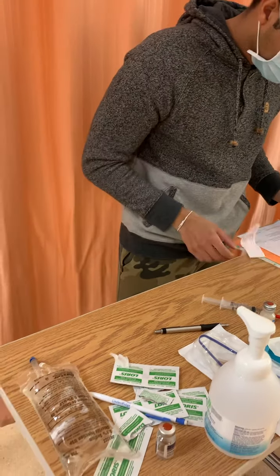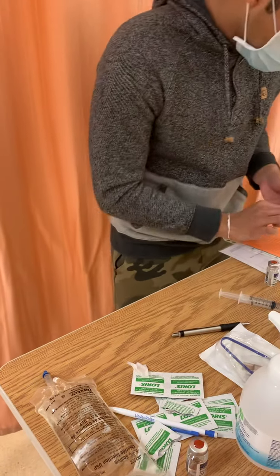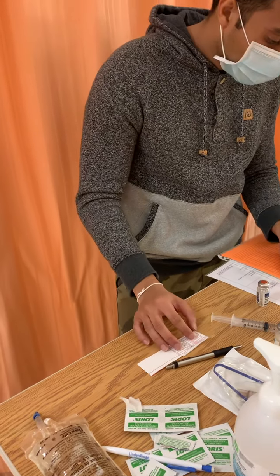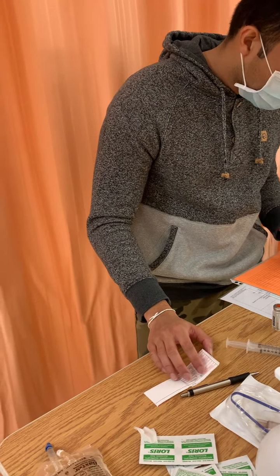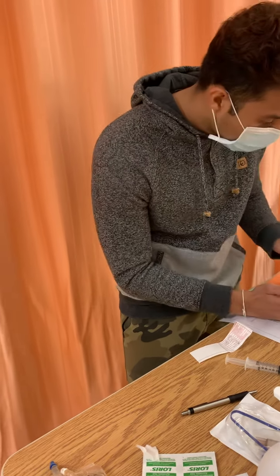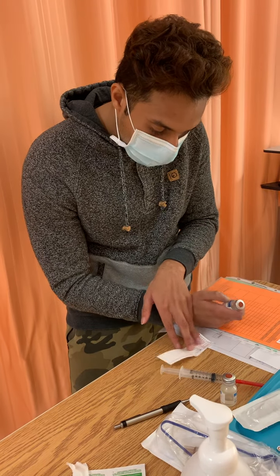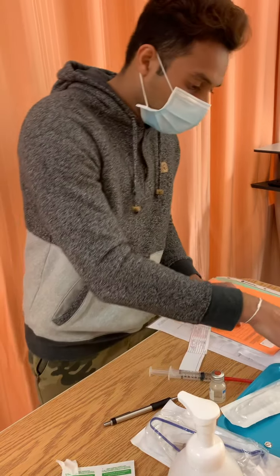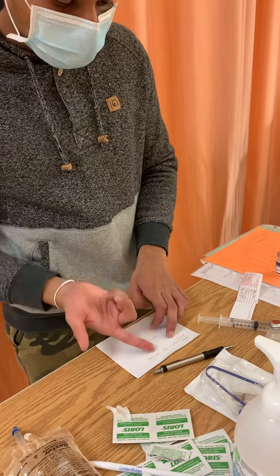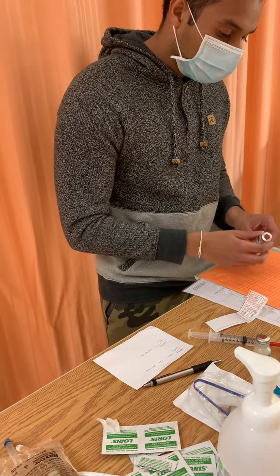So we have here our MAR, medication here. And so we have our patient, Watson-William, and this is our pre-labeled med label. So it's Watson-William, and they're allergic to shellfish. And we see that the medication here is Azithromycin. It's 400 milligrams, 500 milligrams in the vial. We pulled out 4 mLs, so 400 milligrams here. And we've done our calculations, and we show that for the 400 milligram ordered dose we're going to draw 4 mLs, so there's 4 mLs in there, and it's an IV medication. This is IV route. It's given daily, has not been given today, so we're going to give the medication now.